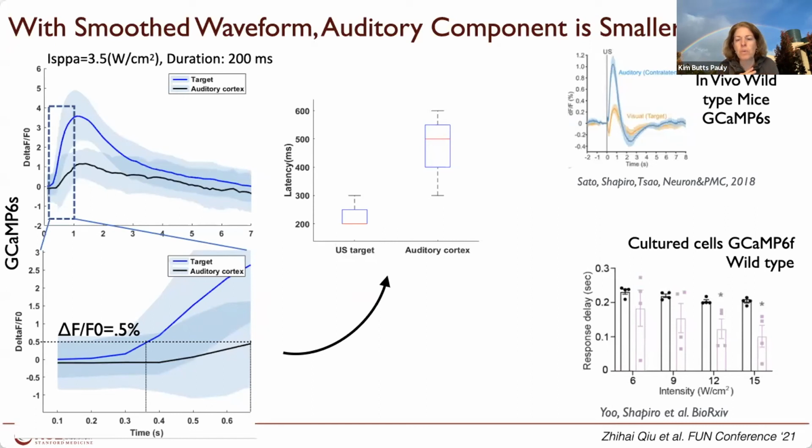So that was one possibility for what those differences were: that the angle effect meant there wasn't as much going in. We were also hypothesizing, to make up a word there, that if you put the ultrasound at an angle, perhaps it creates more surface waves on the bone, or what is mimicking bone in our situation. That's something we really don't know the answer to. So I could potentially have amplified the sound while diminishing the target just by having gone at an angle.